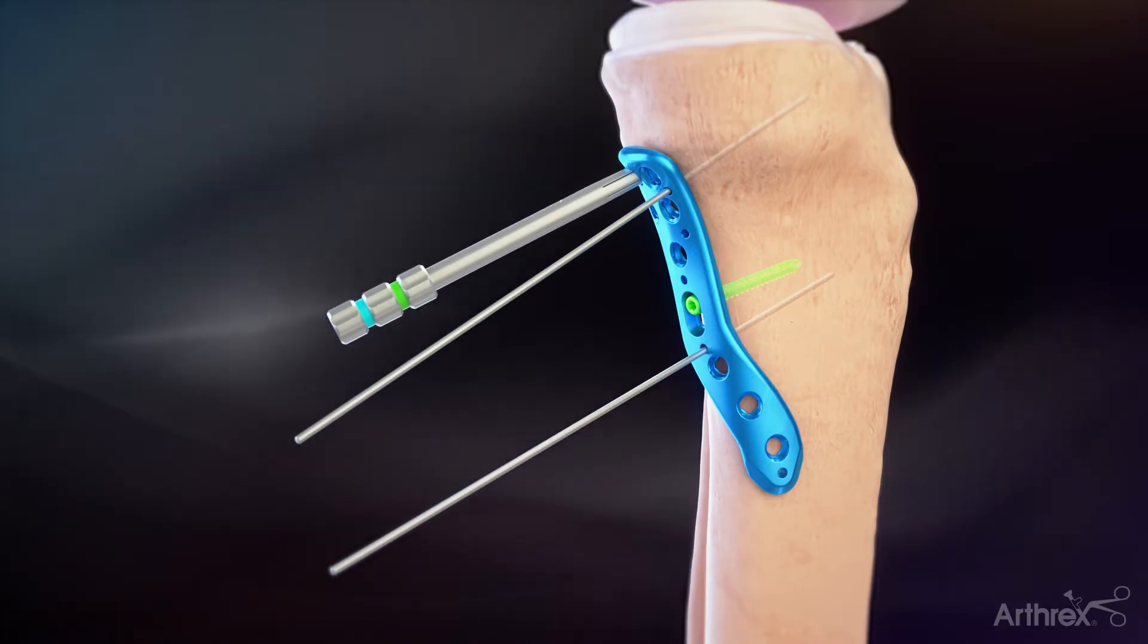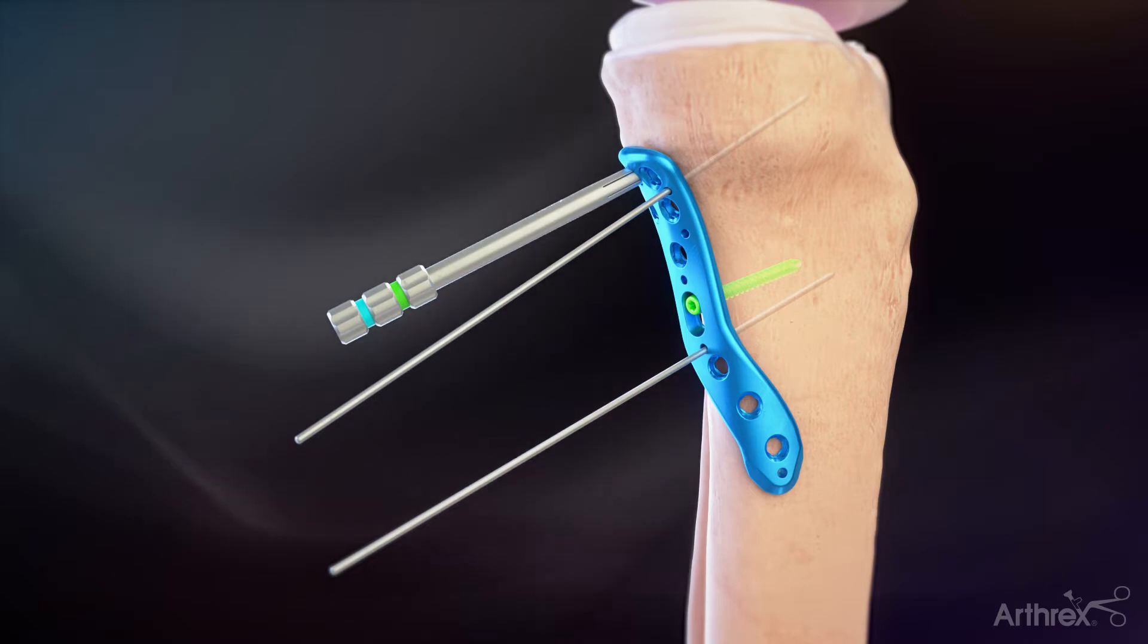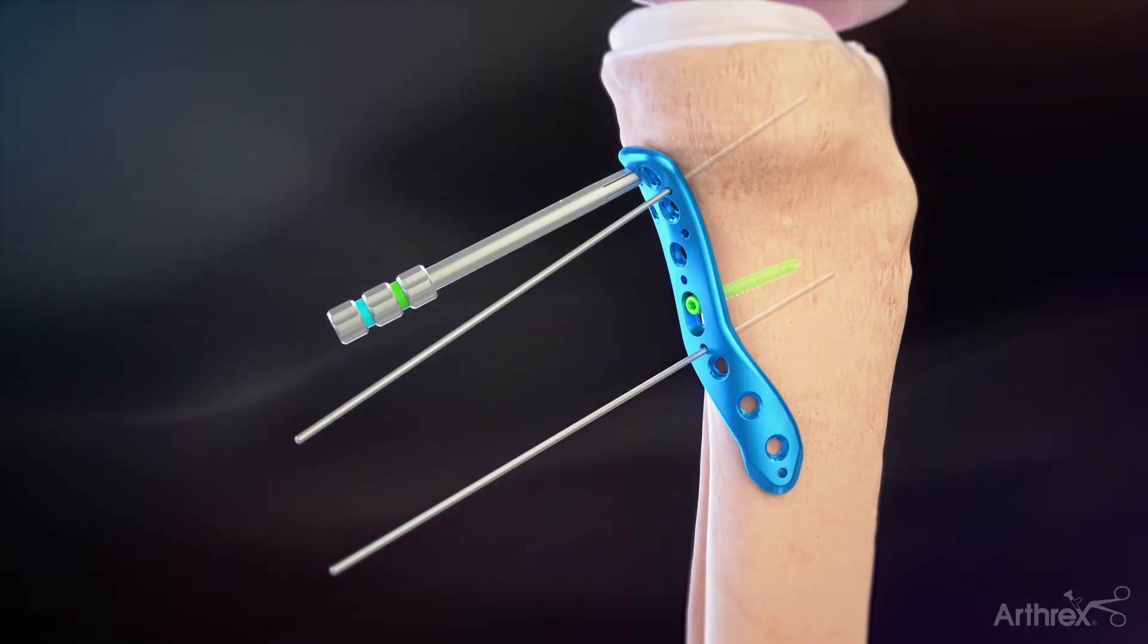The 2.8 mm fixed angle snap and drill guide can be used for the 4.0 mm fixed angle locking screws, 3.5 mm cortical screws, or 3.5 mm variable angle locking screws when drilling at the nominal angle.